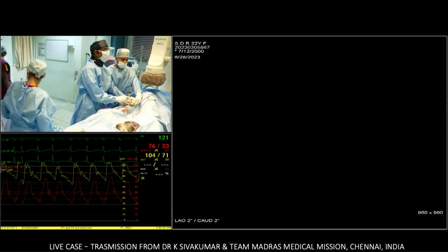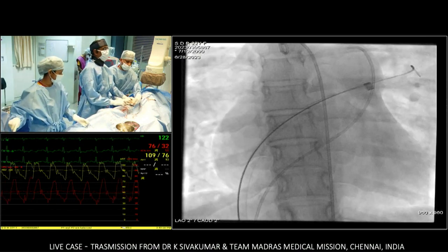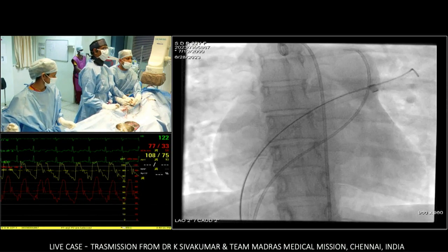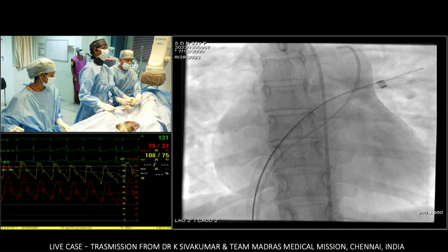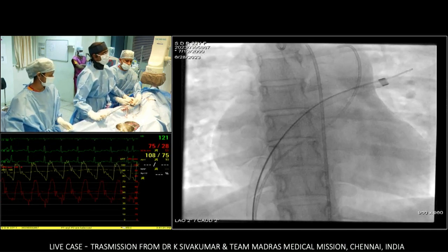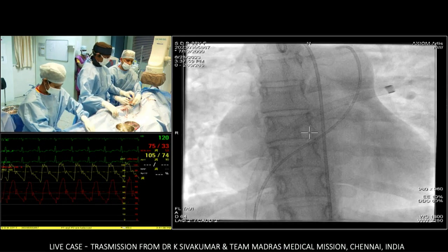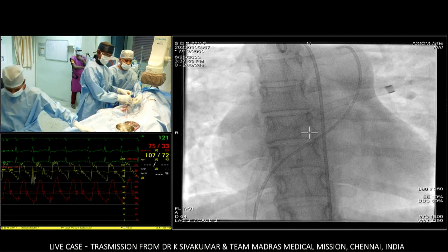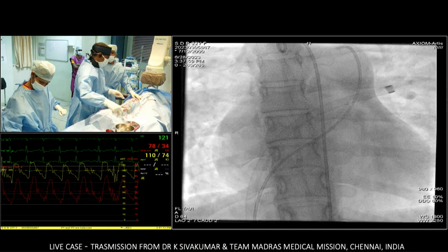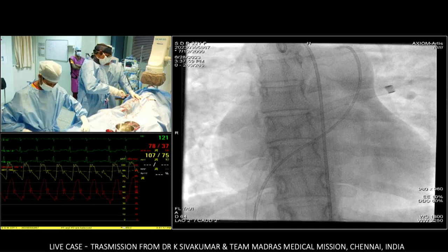What kind of fenestrated device are you going to put in? I mean, an ordinary device, you put a small hole, a couple of holes. What's your precise policy to fenestrate an ordinary device? Well, what do you do for Mario? Well, I'm a very simple man. I just put a needle inside and do a balloon, or maybe a couple of small balloons, in order to have two little holes that are likely to get closed spontaneously with time.